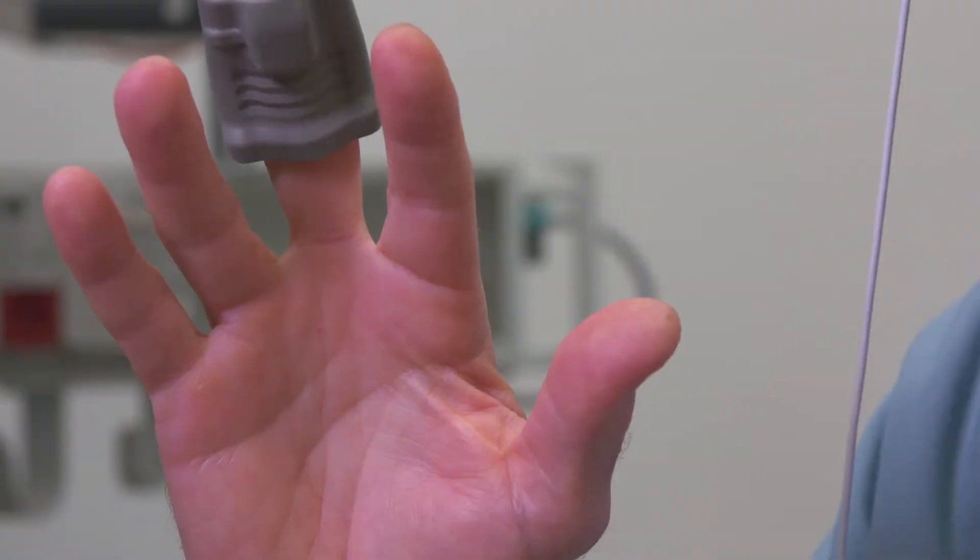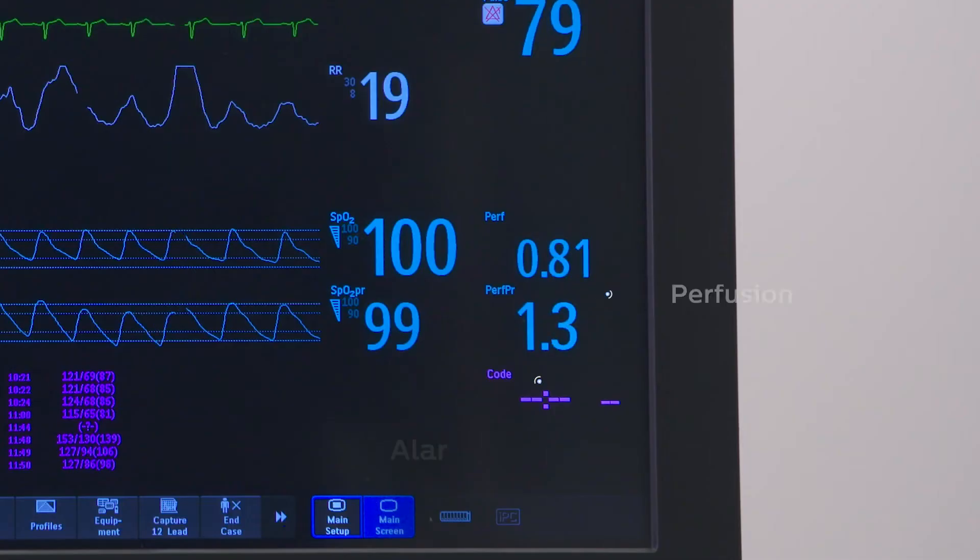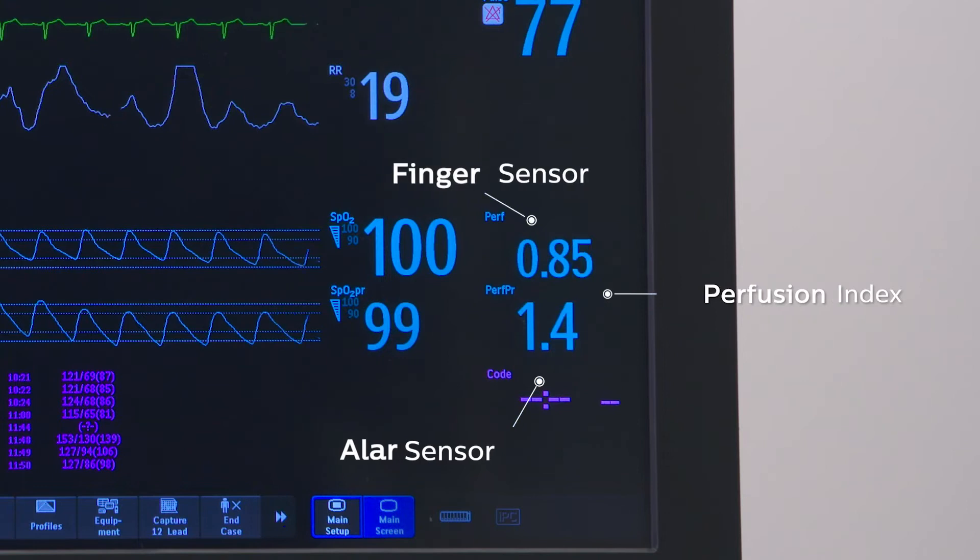I'm intentionally wearing two pulse oximeters — one on my finger, one on my nasal ala — and the idea behind this is to demonstrate the difference in signal strength of the two locations as evident on a monitor when you look at the perfusion index.